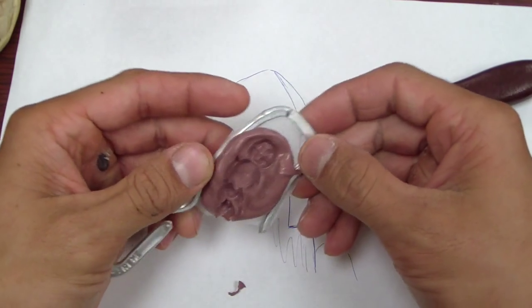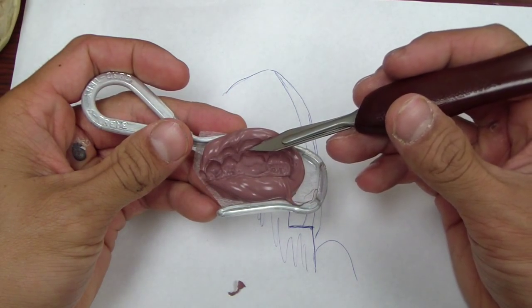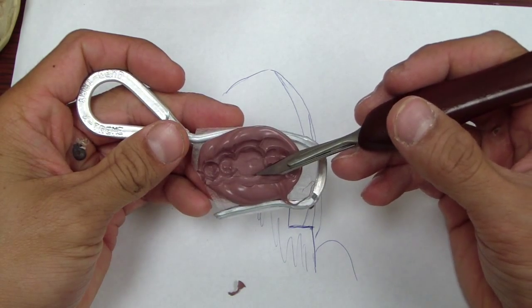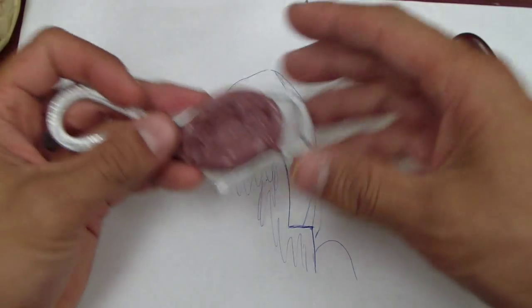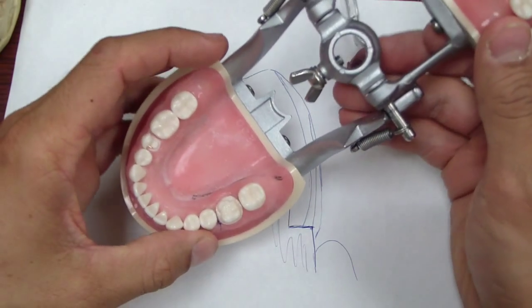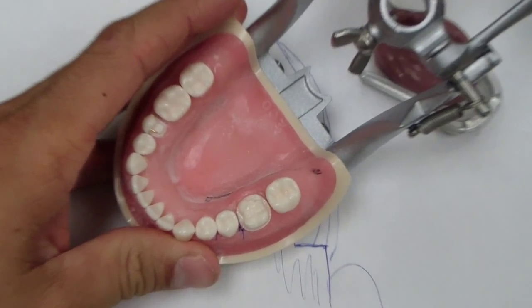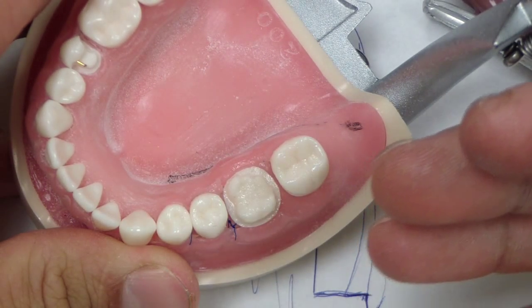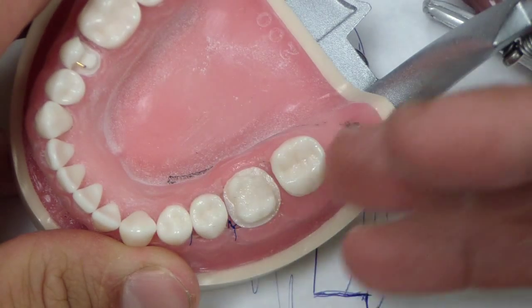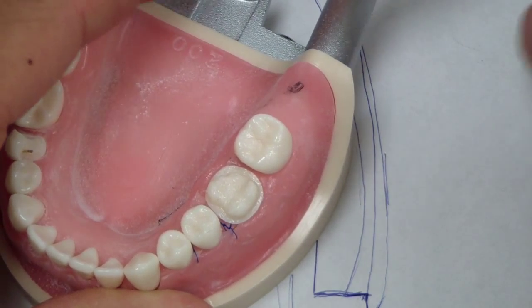There we go — you can see now that we have a little bit more provisional material left around the gingival margin, to which I can polish back. So now, as I said, we've prepared our tooth. What we're going to do next is fabricate our provisional restoration, hollow it out, place a pin or do whatever we need to, and then lute down our provisional restoration and then place our foundation restoration.